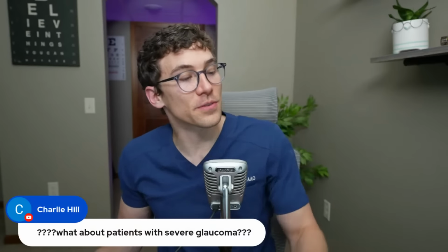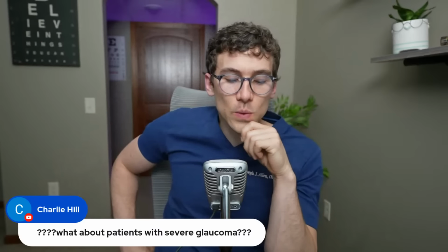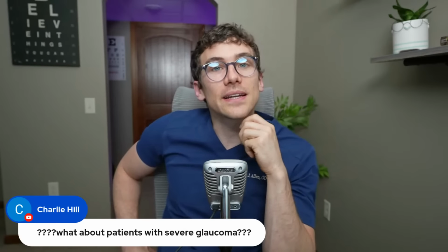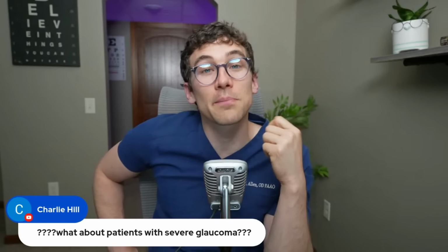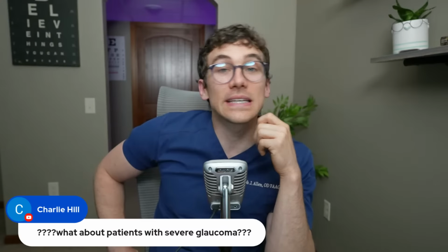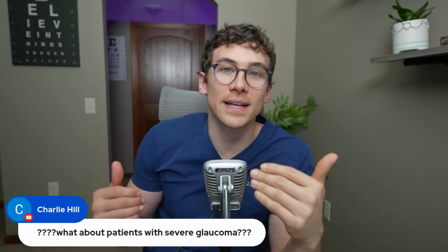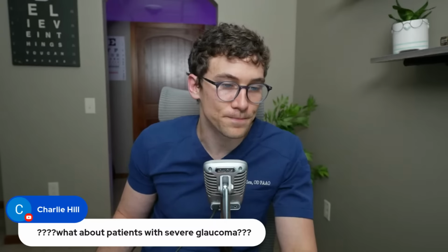What about patients, from Charlie, with severe glaucoma? Same thing with the question about retina disease. If somebody has severe glaucoma or limited vision due to glaucoma, then something like the enhanced depth of focus lenses or multifocal lenses may not be as recommended, at least at this given time, because it's believed that with the reduction in contrast sensitivity, perhaps those lens options aren't the best.